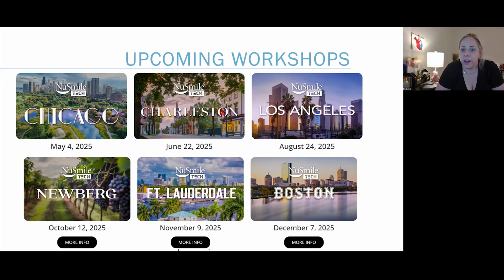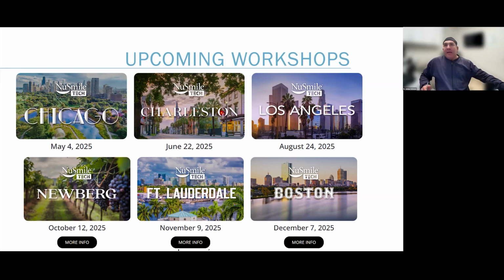Perfect. Okay, Dr. Masai, a couple of times I have had patients come back with irritated, inflamed papilla. Is this from too long of stage 1? It may be too high of a volume. And the other issue is, I don't necessarily think it's volume if you're only giving 5 to 10 seconds. Many of us, when we first start doing this, are heavy-handed on the needle entry.